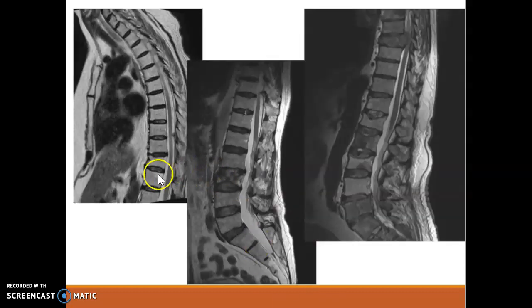Looking at these ones just here, you can see you've got crush fracture of the vertebra here. Looking at this here, this doesn't look right. So based on looking at disc pathologies and looking at discs in general, this expansion of the disc and destruction of the vertebra itself would indicate that there is something going on here, whether that be bony mets that's causing destruction.